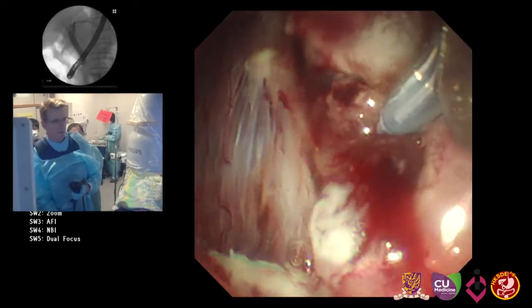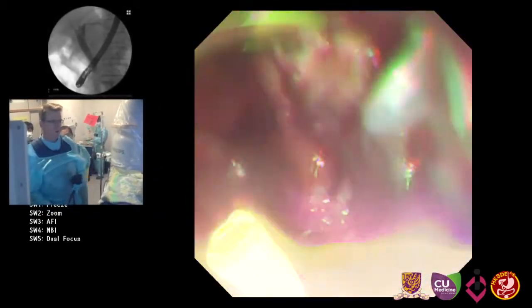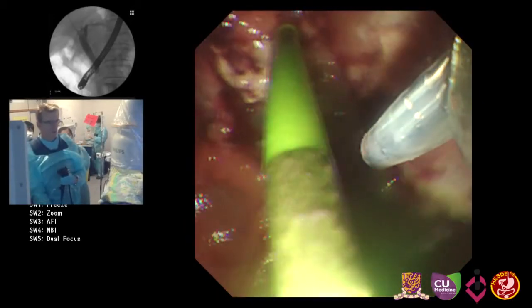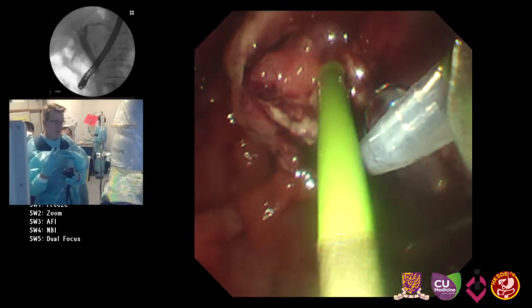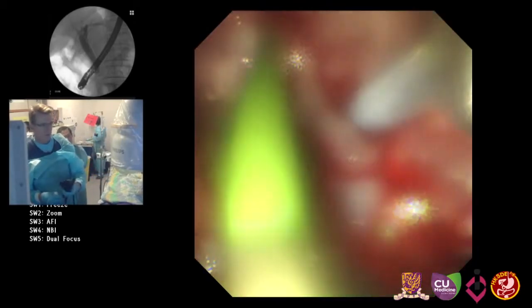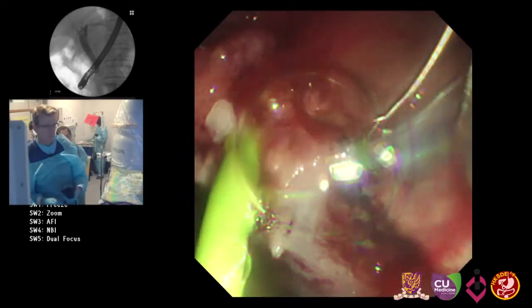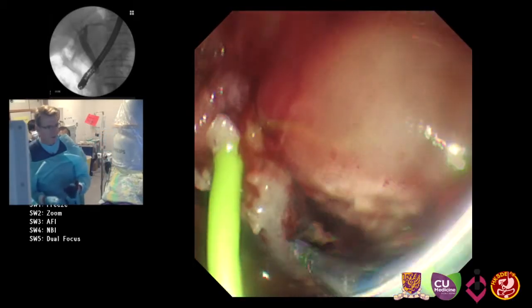So we had quite a bit of bleeding, which is always expected with ampullectomy. And this is a truly laterally spreading tumour. It spread beyond the boundaries of the papilla and sort of down back. The papilla was prolapsed into the duodenum. It grew over the sides and then down and out. So I think you can see on this side, if we just irrigate, you can see that the line of the resection goes way out to the side.